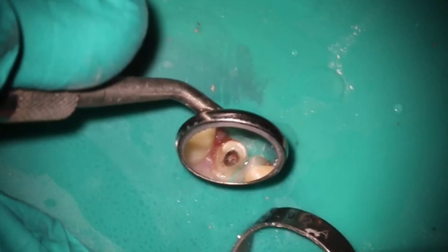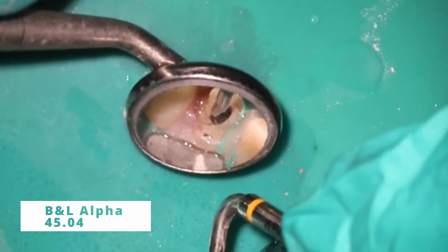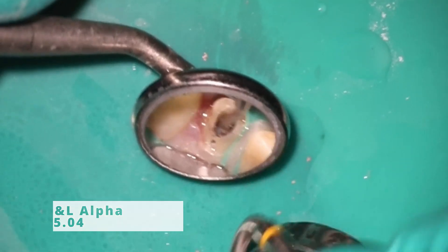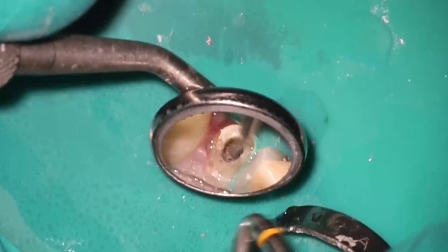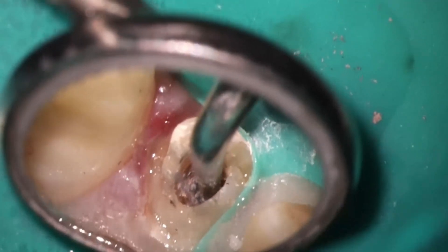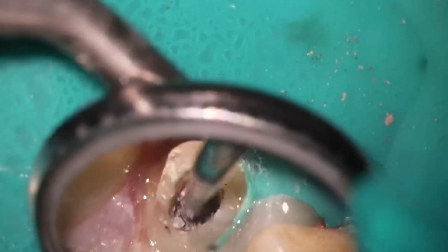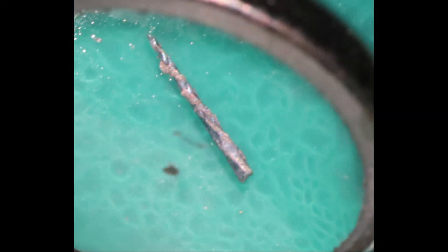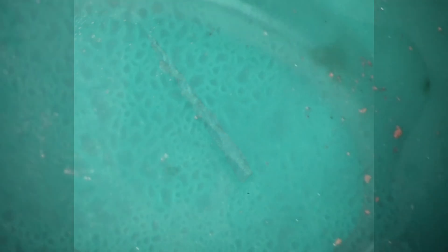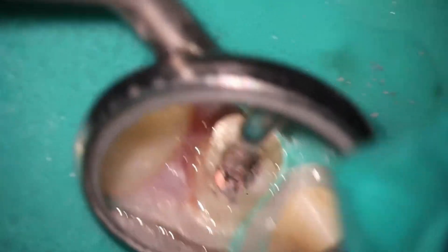Now we have to go after everything else. I'm going to come in with the alpha and start the traditional retreat. I'm not even worried about the F1 file — it's going to be probably along the side of that little path the post drill made anyway. This is where that heated tip makes a big difference. I'm trying to get the F1 out, and actually the F1 does come out first — popped out super fast. Not worried about that whatsoever. The post drill is going to win most times, but I needed to create a little space. And what do you know — it is a thermophil carrier.